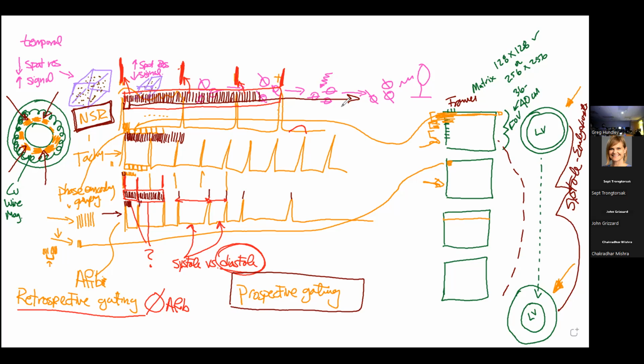And so the scanner is going to sound very different. It's going to go ma, ma, ma, ma, ma, ma, ma. It's going to make sounds because it's going to look for the QRS, and then it's going to activate the scanning process when it sees what you've identified for it to recognize as the appropriate interval of time. Now, one thing that's kind of nice about this strategy, whether we're dealing with normal sinus rhythm, tachycardia, atrial fibrillation, or even an irregular rhythm with PVCs thrown in, is you get automatic averaging with either of these techniques.